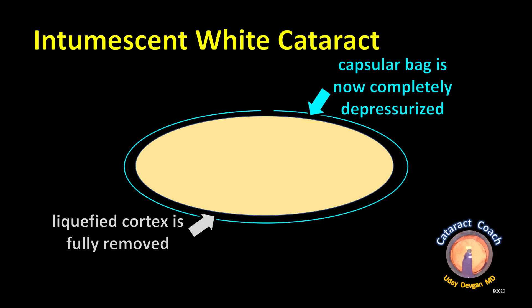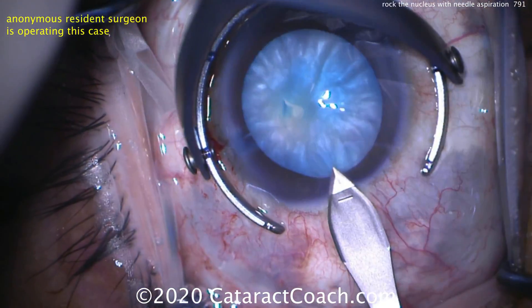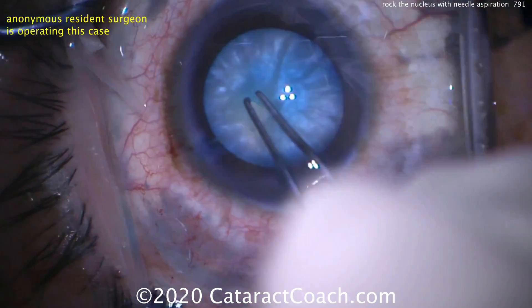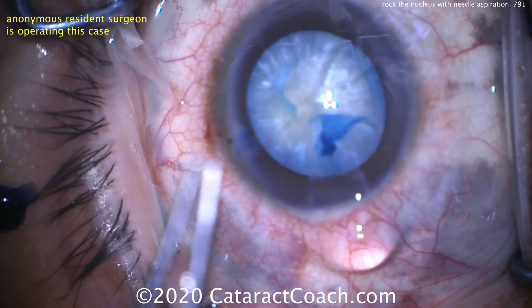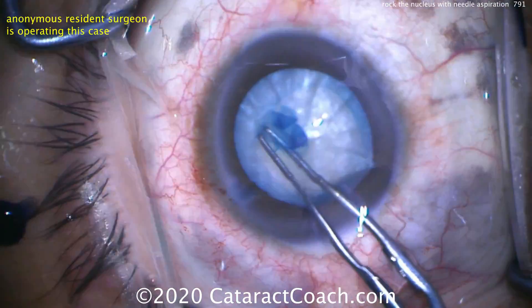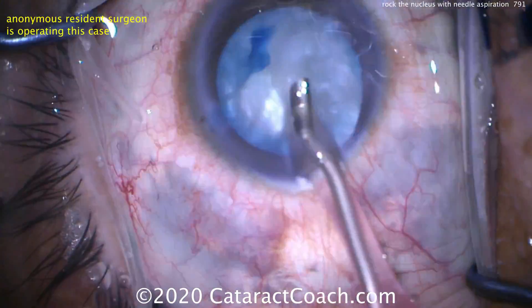It's much easier to proceed with the case now. So now that we've removed all that liquefied lens cortex, we can make the incision and do the capsulorrhexis. The incision is being made — we've sped up this video. You'll see it's complete control during capsulorrhexis creation. The resident is able to create a very nice capsulorrhexis without any issues. Grabbing here with the forceps, bringing it around, and there's no pressure to push towards the zonules. Normally you'd have the rhexis wanting to run out because of the posterior pressure of the nucleus due to the liquefied cortex that was trapped — but we removed all that.